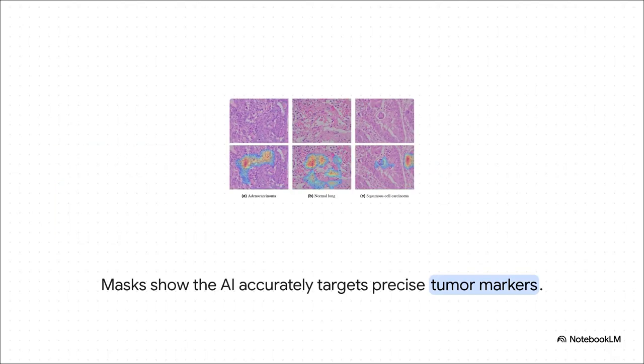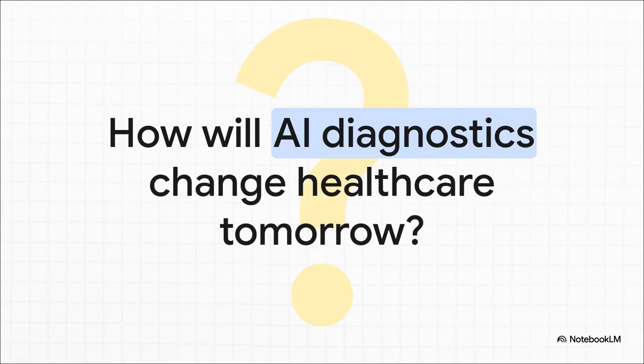This just brilliantly illustrates the impact of the LungHist700 methodology. Because the foundational dataset was structured so rigorously, without any data leakage, the AI learned the right lessons. It learned to actively target the precise microscopic markers of different lung carcinomas, seamlessly adapting to the visual differences between the glandular tumors and the squamous tumors. It's a massive success.